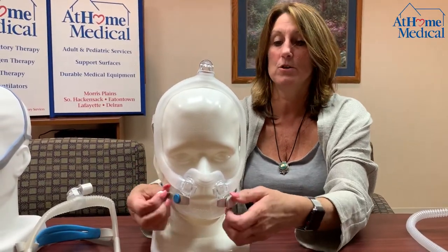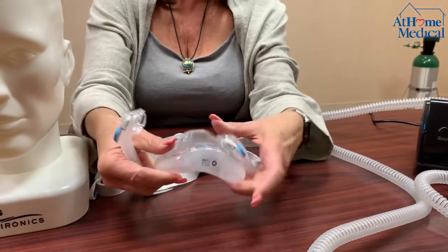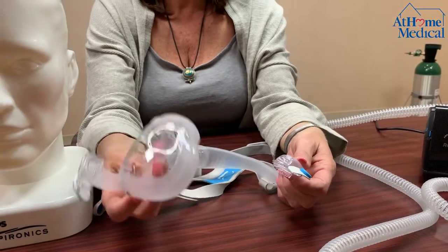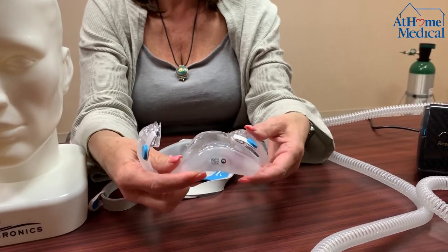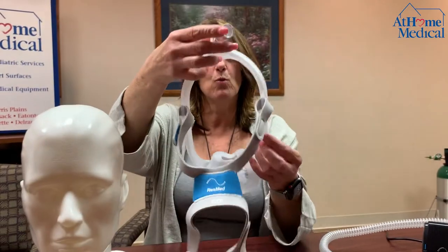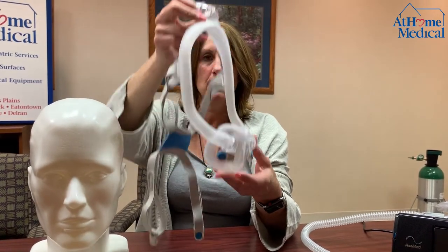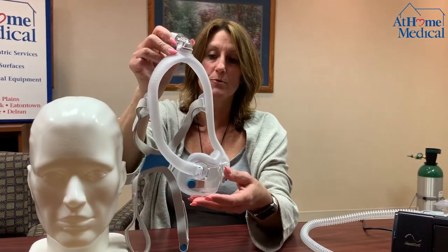Every mask you want to take apart to clean. With this full face mask they made it very easy — just take your thumb, pull it out, wash it under soap and water, and push it back together. Also run soap and water through the headgear and rinse it out with warm water. Hang it over your shower bar to drip dry.